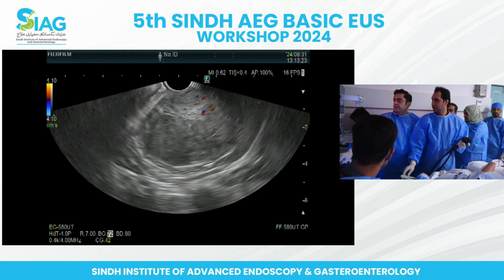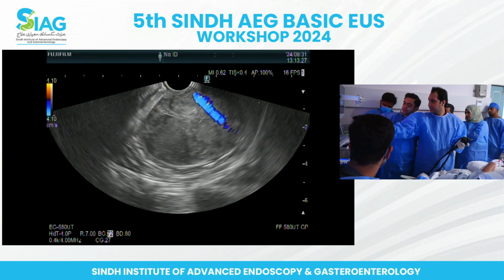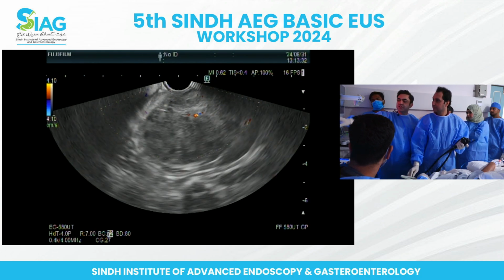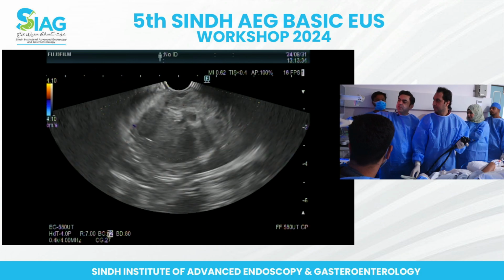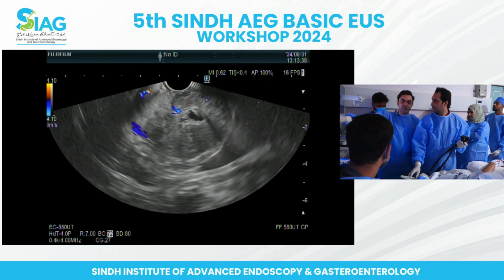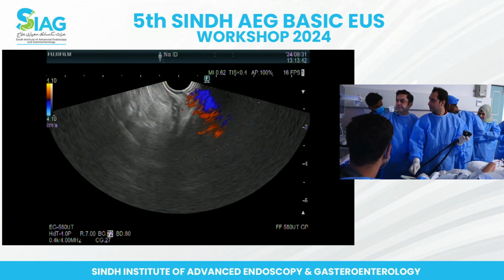Okay. So we can appreciate the deeper layers. It's difficult to say on this size whether it's... What you're trying to say is that if you were really wanting to see the layers, you need to go to the normal and then trace it up, as we were discussing. But this is the normal.